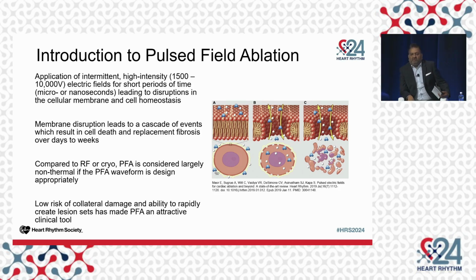And compared to what we consider to be thermal energy sources, whether it's heat or cold, PFA is largely non-thermal. There are some thermal effects, but generally speaking, not ablative thermal effects. And this is really related to the waveform, the design of the catheter, the generator, the shape, and all these things.